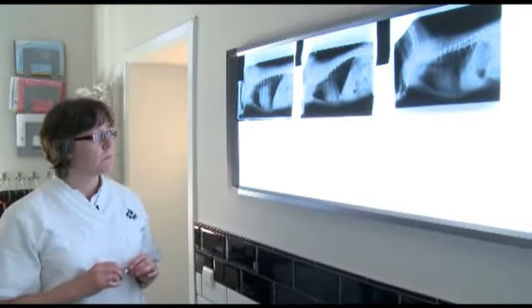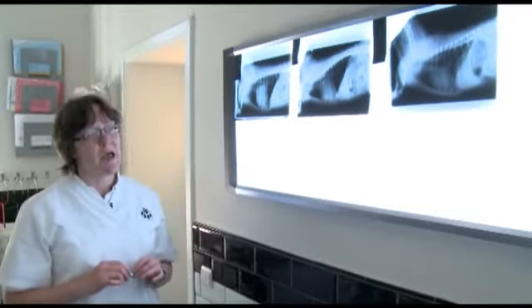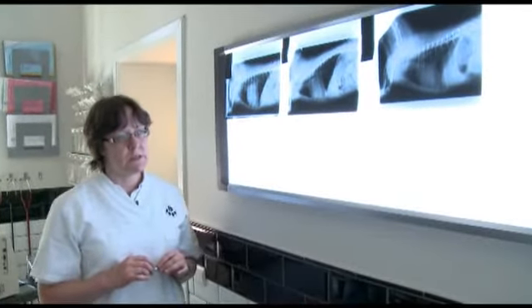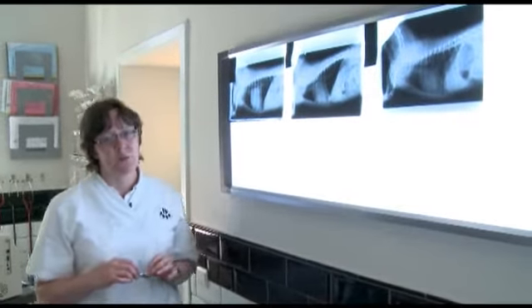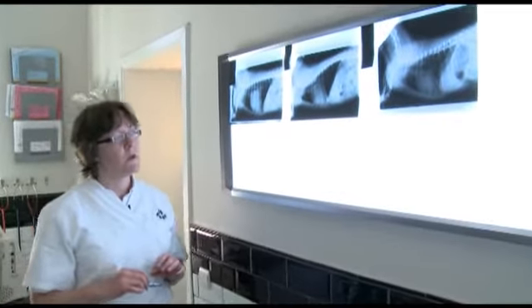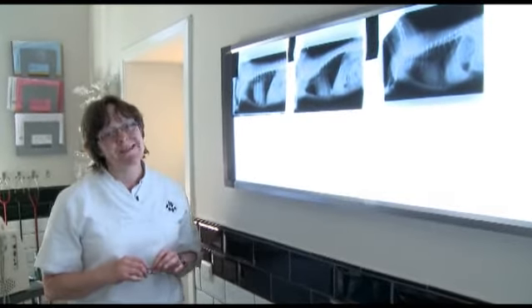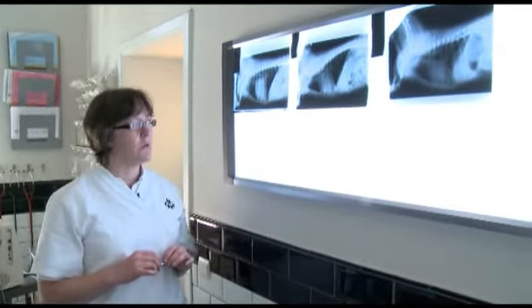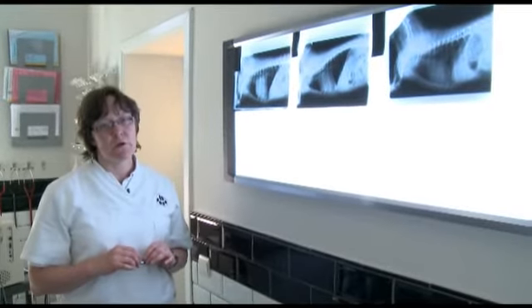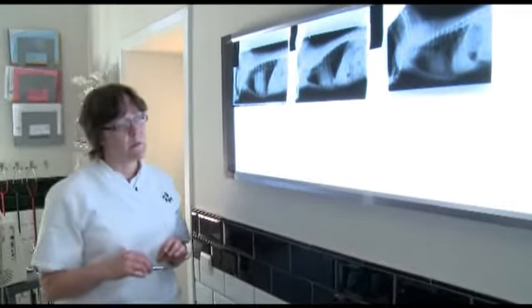However, many of these small breed older dogs have concurrent respiratory disease, and it's not because there is the presence of a heart murmur and some left atrial enlargement that the cough is also purely cardiac in origin. It is therefore essential to make chest radiographs in every dog that is coughing, to see if the reason for the cough is purely cardiac, respiratory, or many times a bit of both.